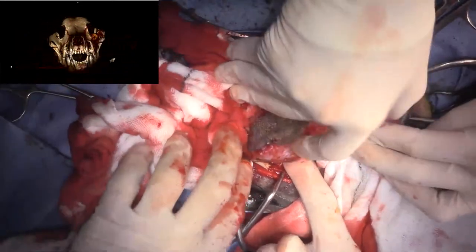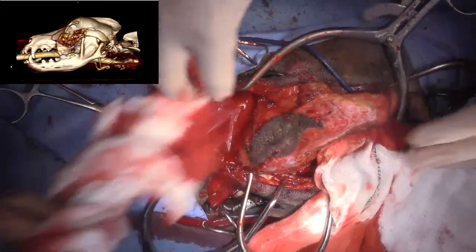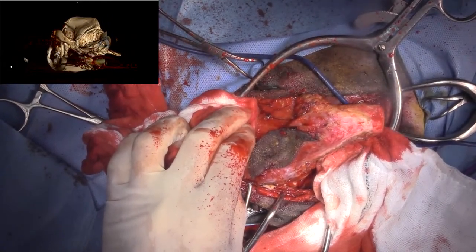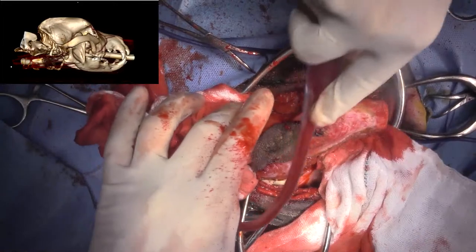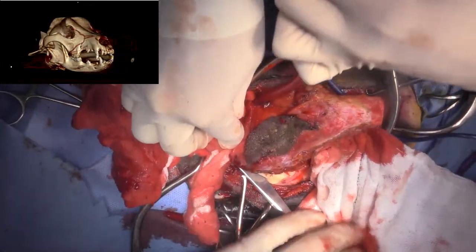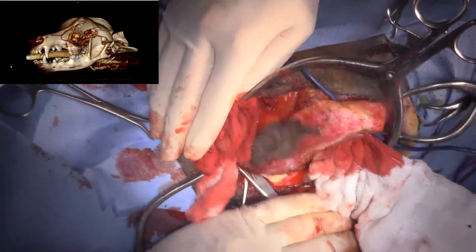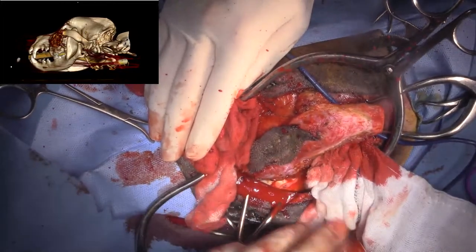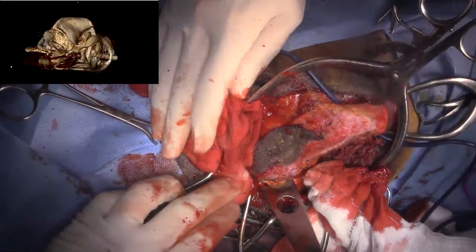Up like this a little bit. I wonder if we can get a bigger Hohmann? This becomes less elegant. Question about whether the rostral orbitectomy is going to include premolar 3, and I'm not sure until I get in there. Just give me some counter pressure. Not sure if this will help me or not. Probably not.